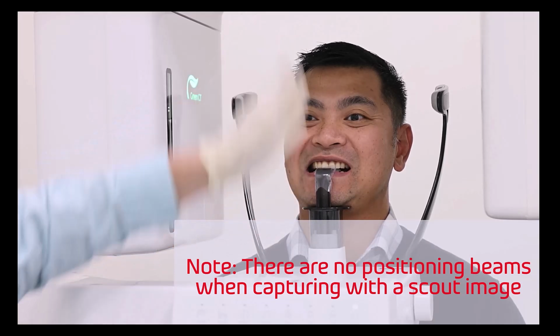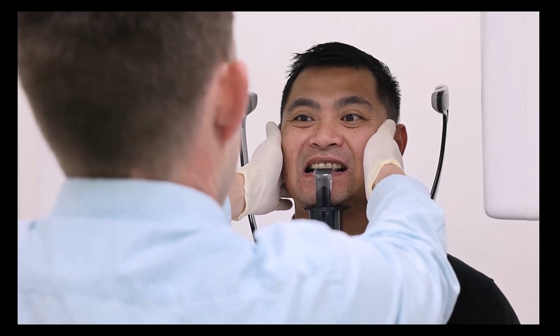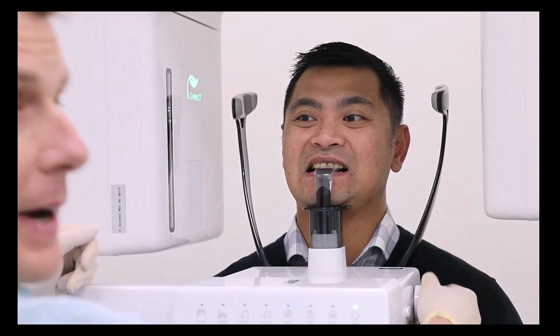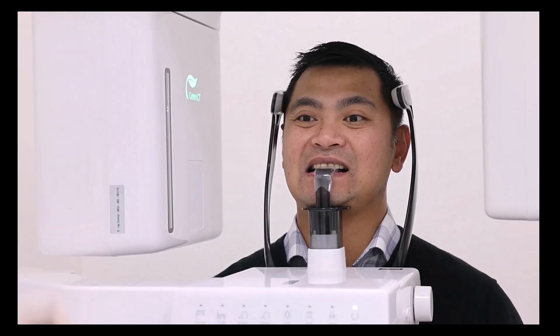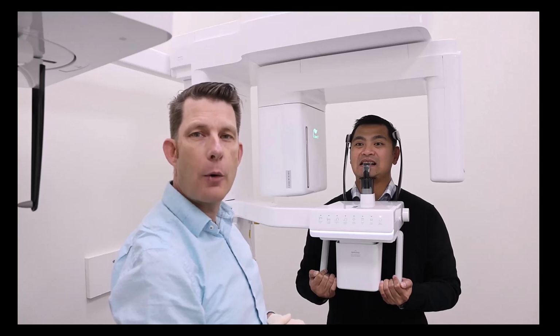Next, I want to make sure they're lined up center. So I'm going to make sure they're lined up center here. Go ahead and close my temple supports. We're going to step out of the room and take our 4x4 scout image.